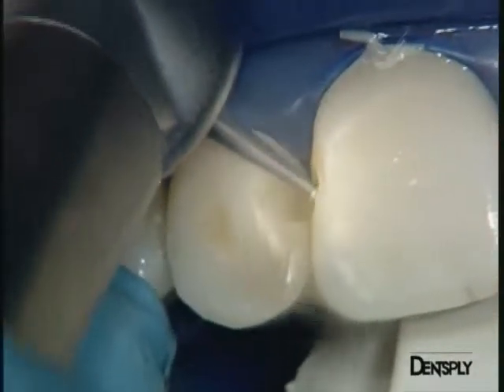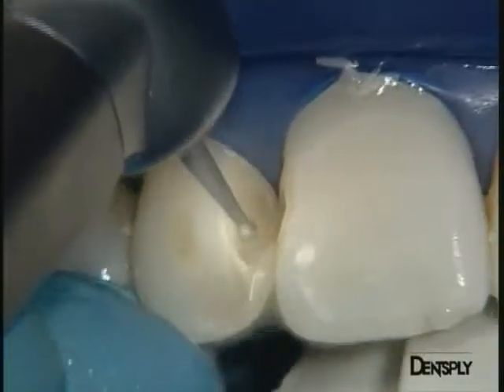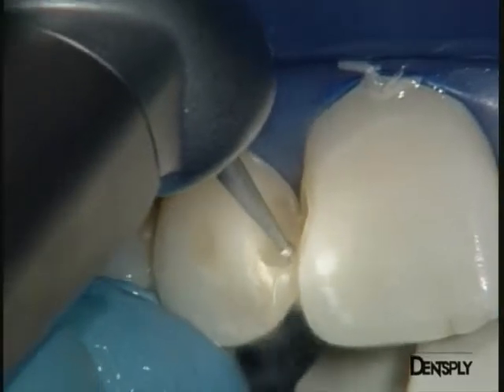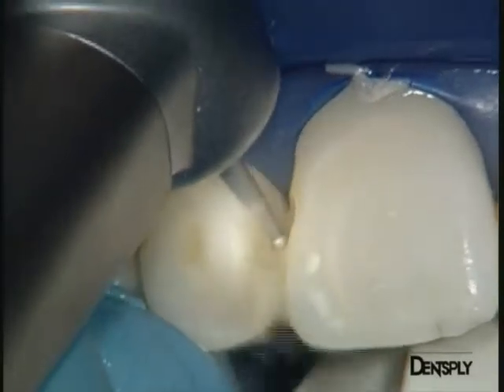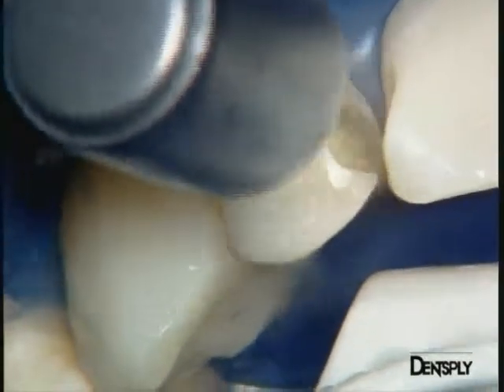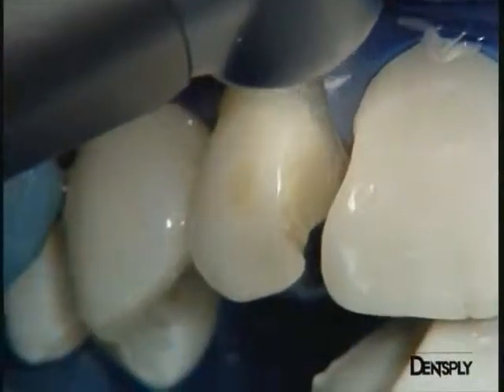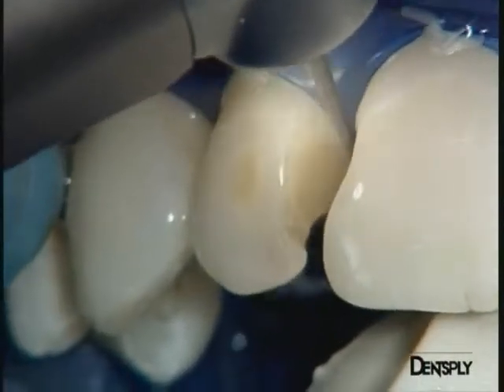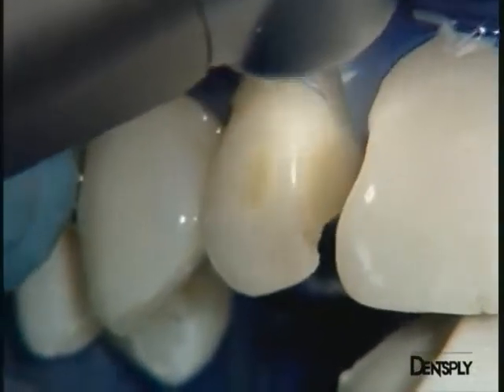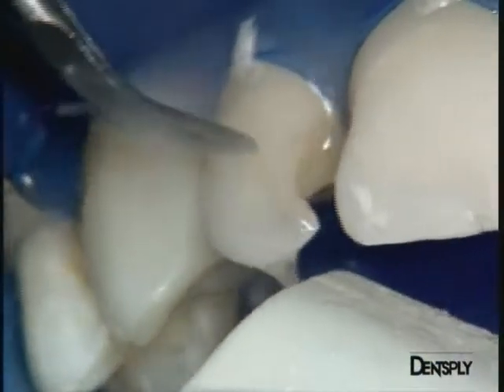The old restoration on the distal part of the central incisor can also be removed. A fine diamond burr is then used to work a little closer to the lingual face, still with a generous spray, and likewise on the central incisor. The small labial composite repair is removed ultrasonically.